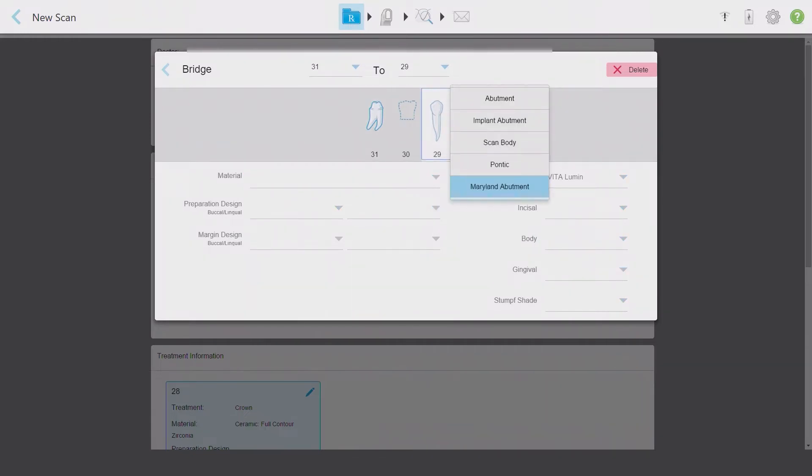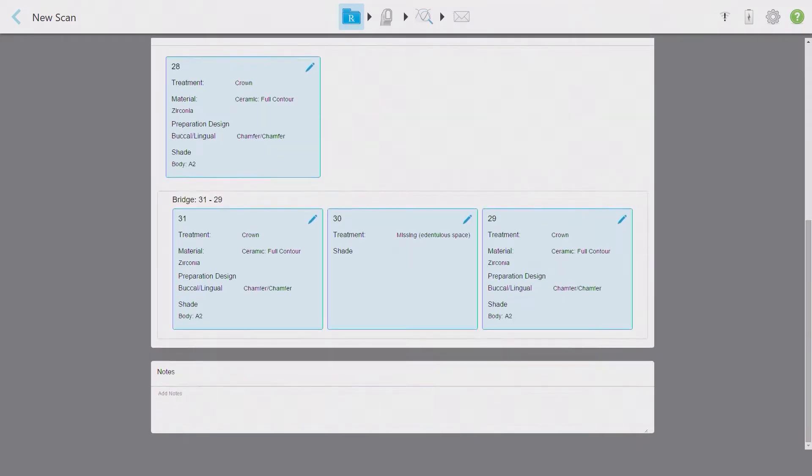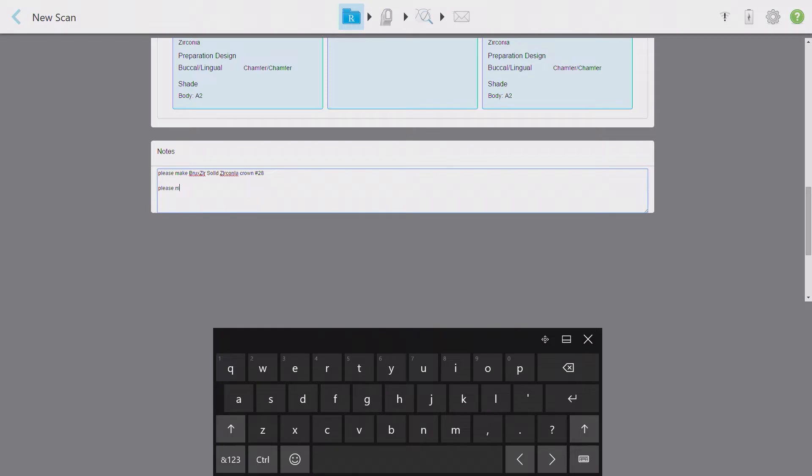Now I can select tooth 29, mark it as an abutment, and then select the copy from tooth option at the bottom of the screen. As long as the detailed information for this tooth matches that of a previously entered tooth, I can select the matching unit and the information will automatically be filled in. Now that all specifics are entered for the bridge, I can go back a menu to the main prescription screen. The bridge is clearly charted now with a red bracket line under the units. I'll scroll to the notes section and enter more details about my doctor's treatment requirements. Since I previously selected full contour zirconia as the generic material for fabrication, I can use the notes section to clearly state that the prescribing dentist would like the crown and bridge to both be comprised of Bruxer solid zirconia.